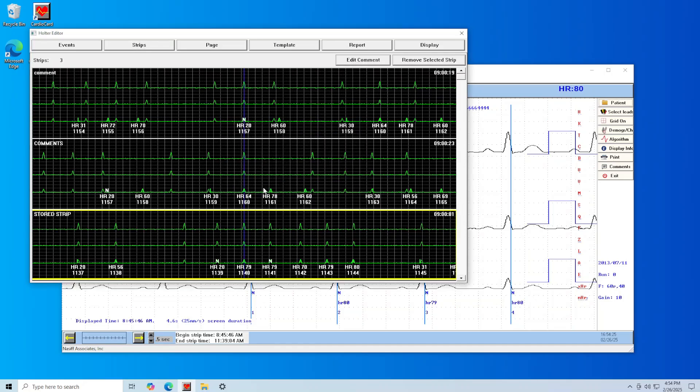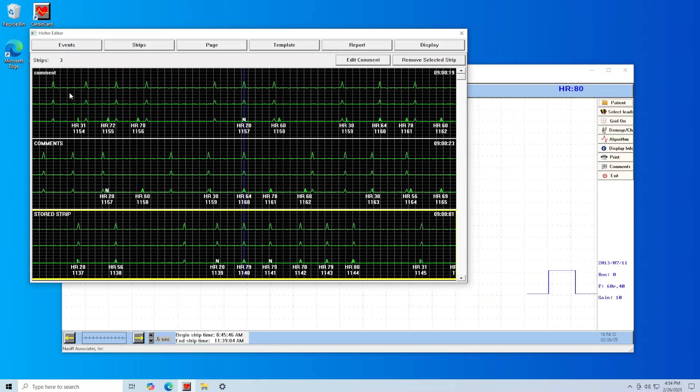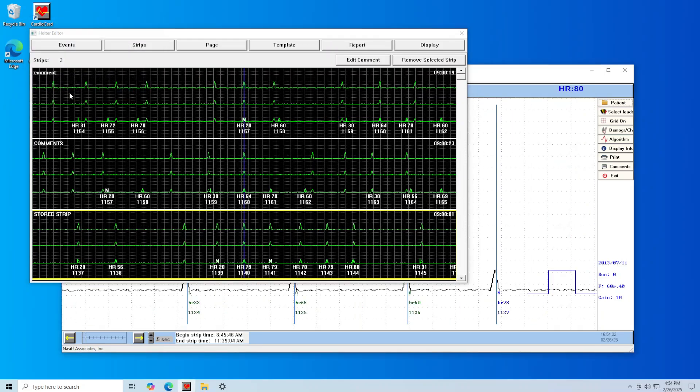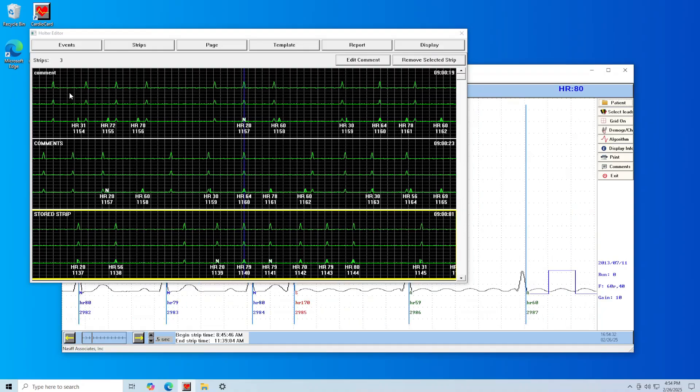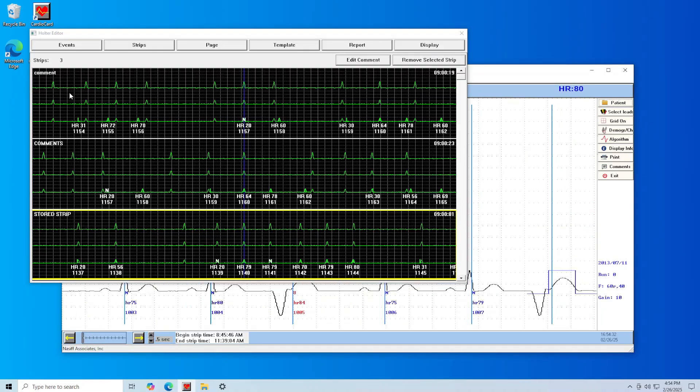To save and view the latest Holter test report with your editing, click on Report at the top right of the condensed editor screen and click on OK in the pop-up. This will generate and view the new Holter report with your editing.